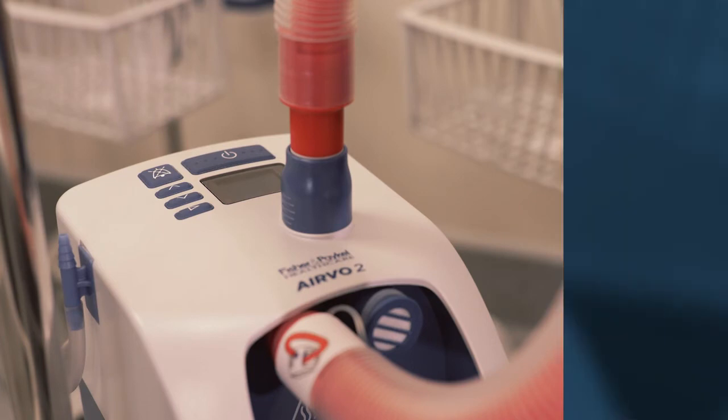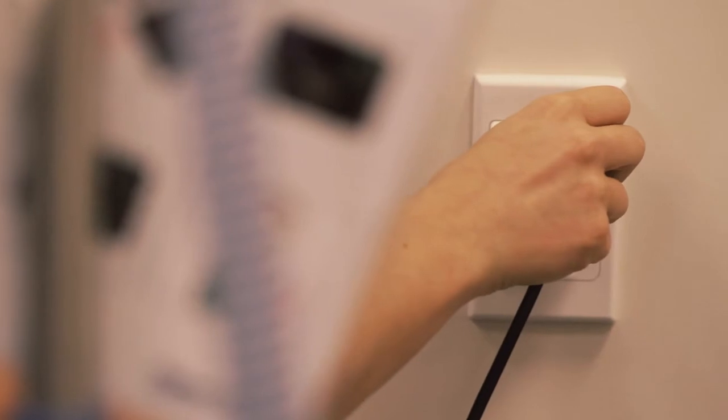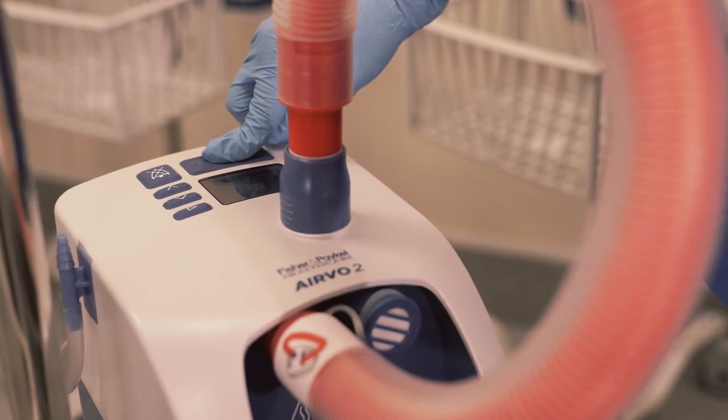The Evo2 is ready for disinfection. Connect the power cable to the mains utility power socket and start the disinfection cycle by holding the on-off button for three seconds until the unit beeps.